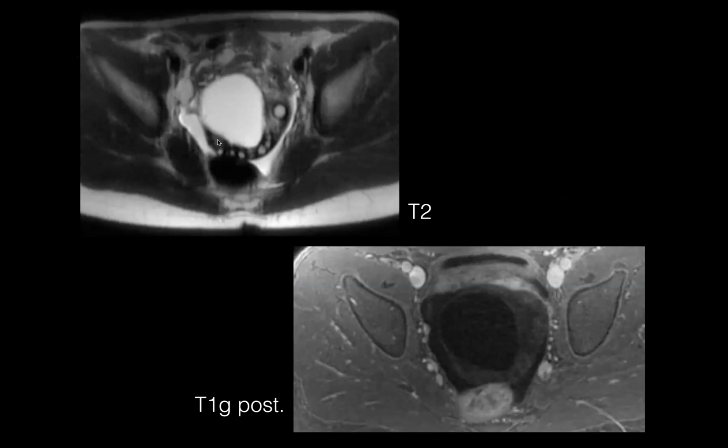One of the things that you'll notice is that there's all these little follicles, right? Normally, once you've reached puberty and beyond, you see these follicles, and monthly one of them matures and then eventually ruptures to release an egg. But in this case, these are too prominent for a 3-year-old. And the tissue in between these follicles is just too bright on these images. So this is reflecting edema. There's too much fluid here. So that's the T2 weighted image.